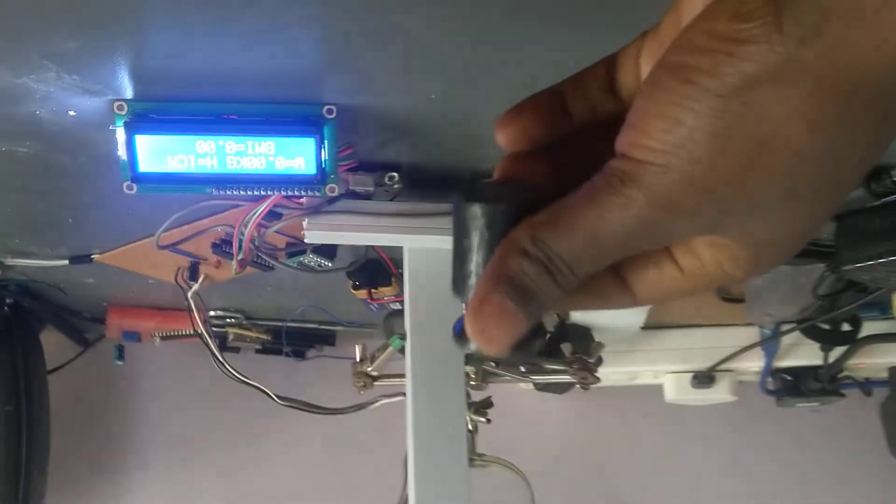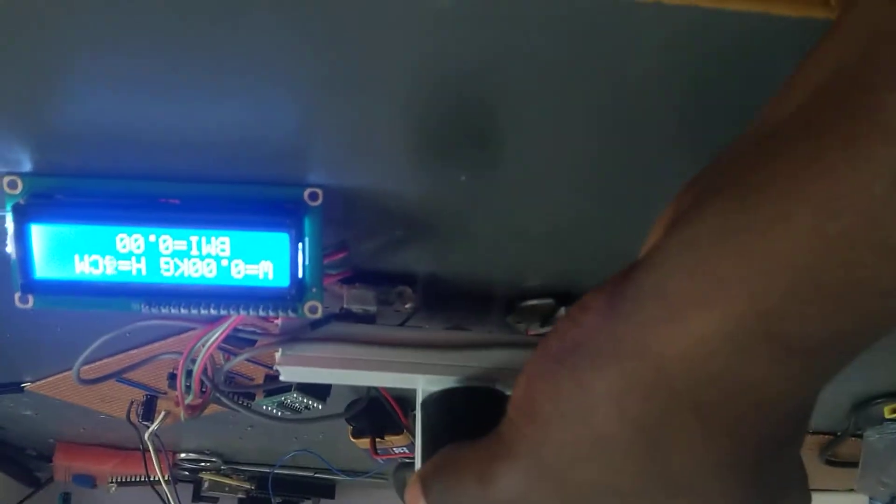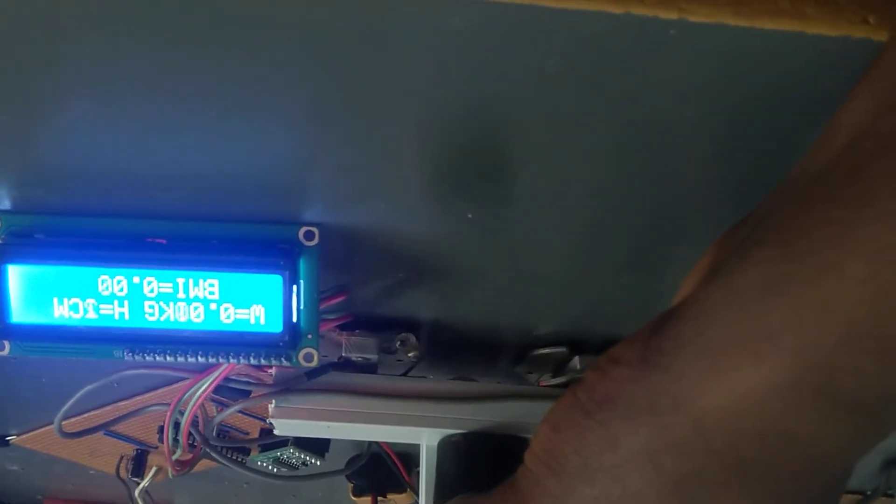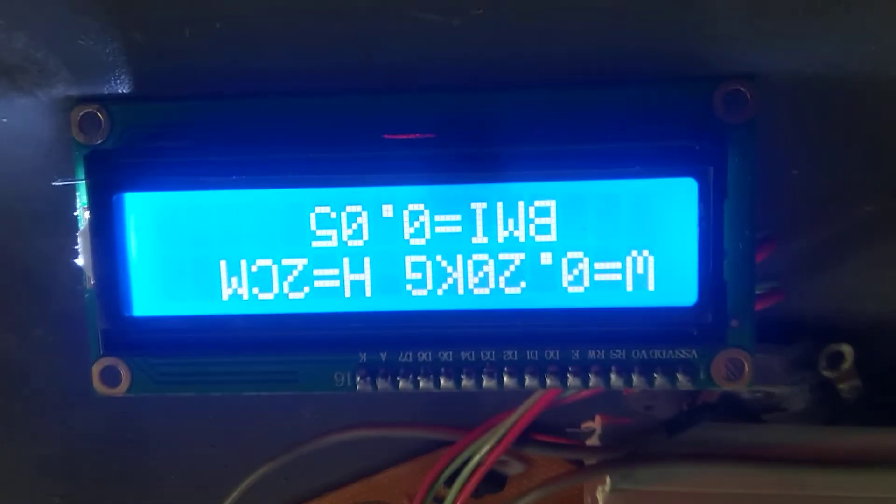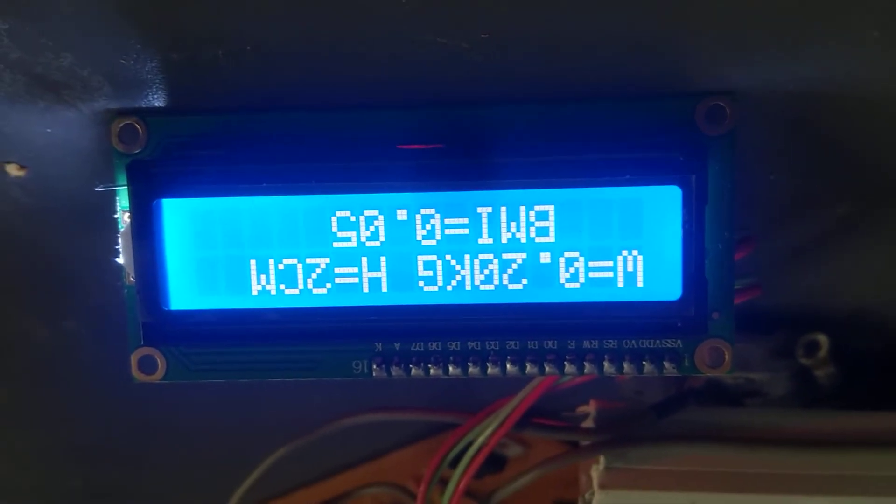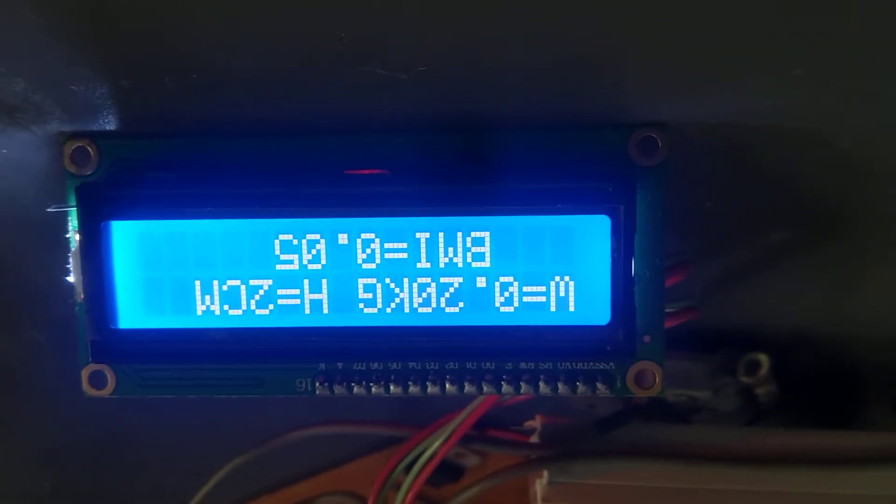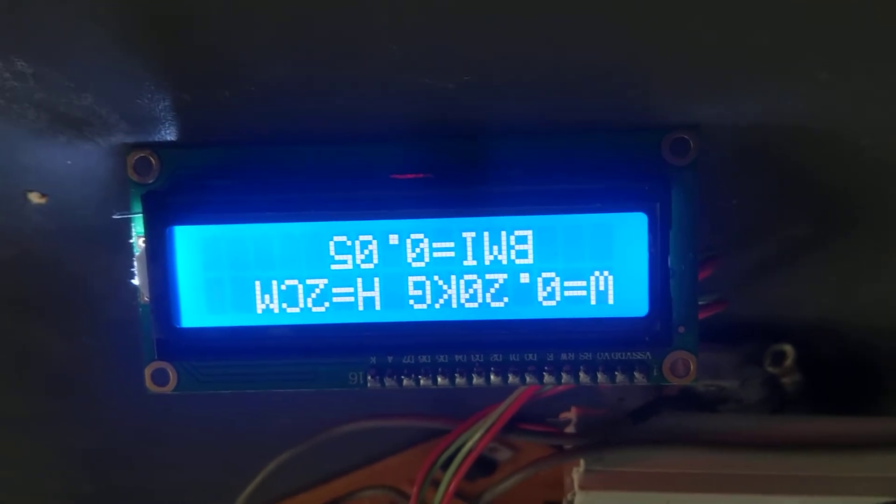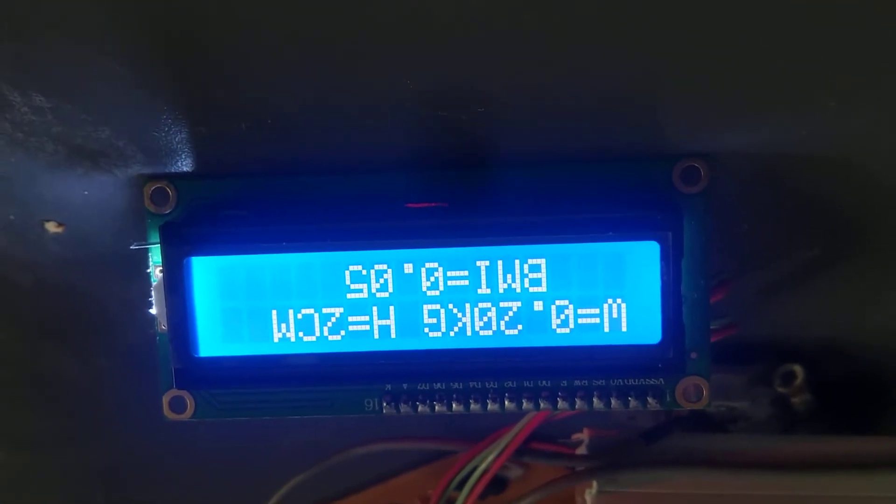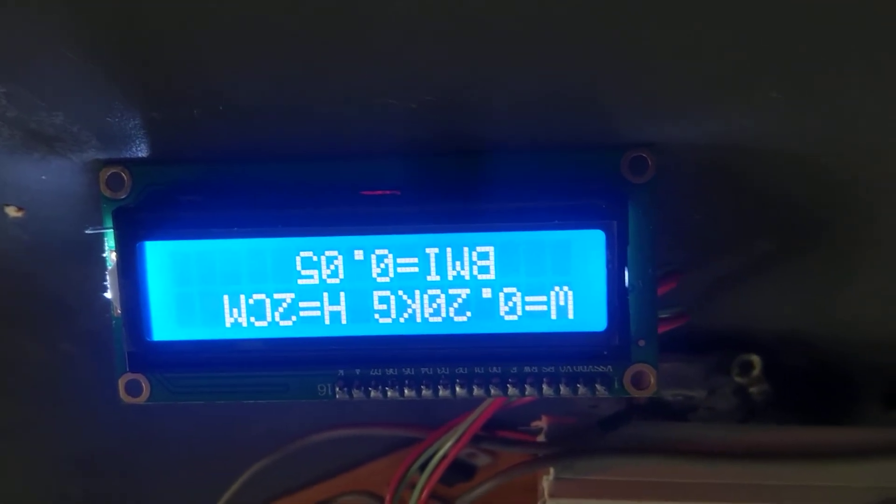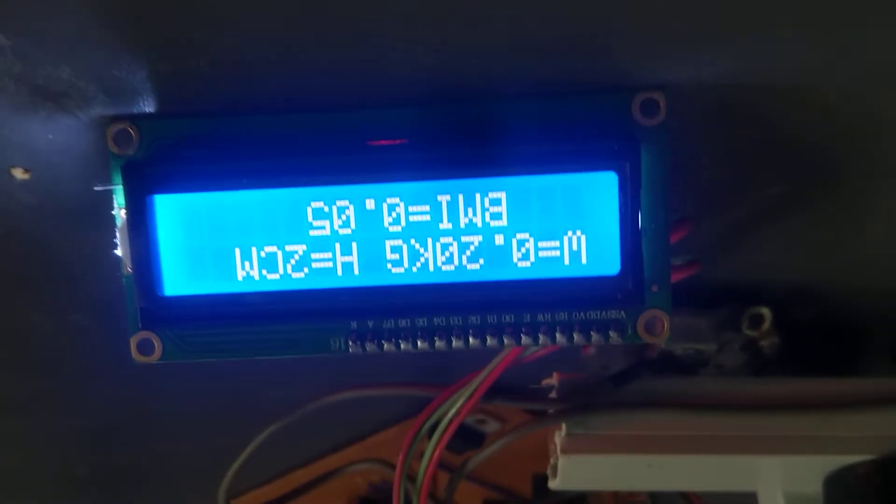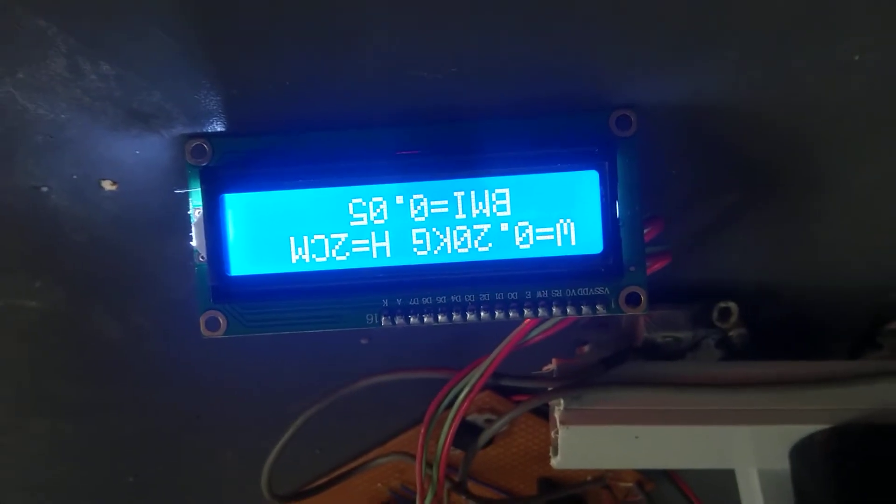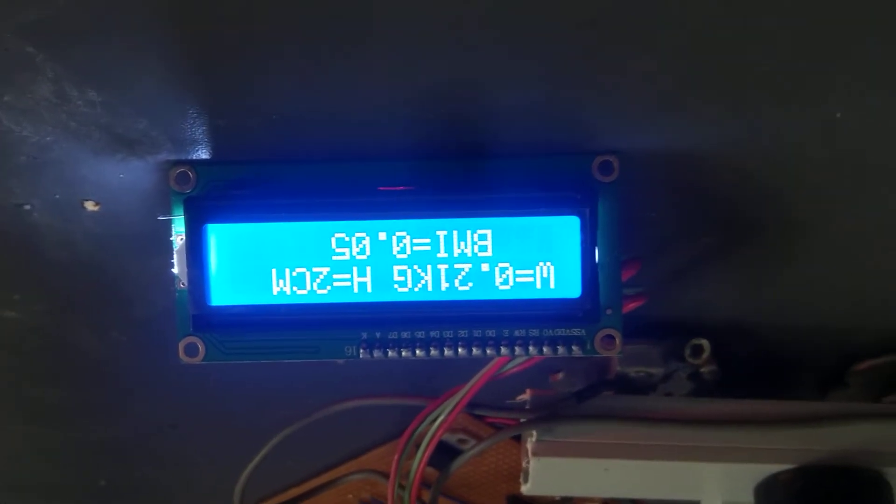I'm going to demonstrate it with this small weight. As you can see, when I place it there, values change here. The mass is 200 grams—0.2 kg. The height is 2 centimeters. Body Mass Index is a calculation done between height and weight; it's normally weight divided by height squared. So as you can see, the BMI here is 0.05.